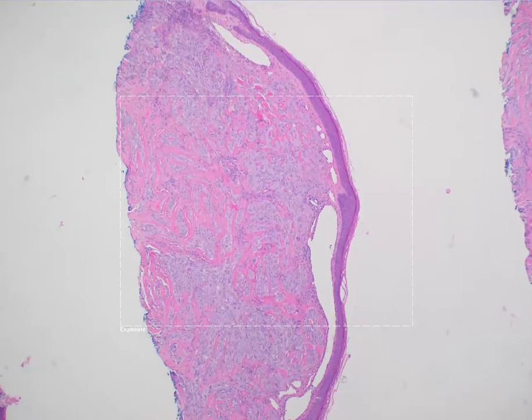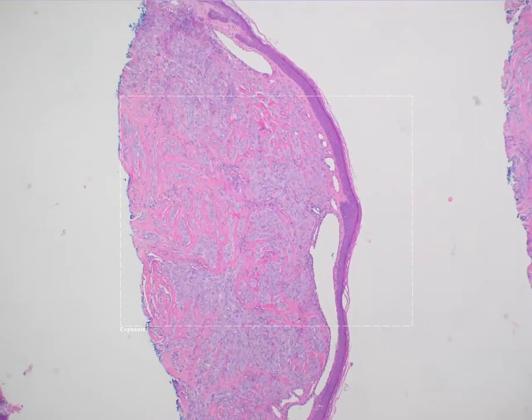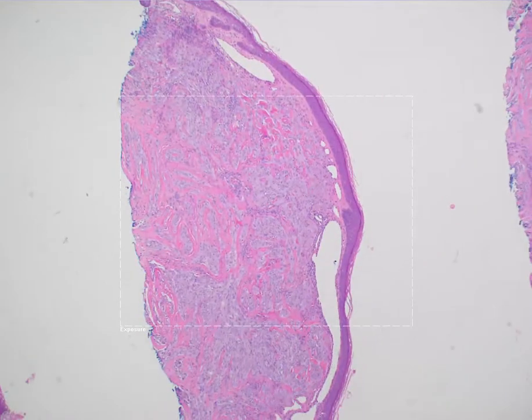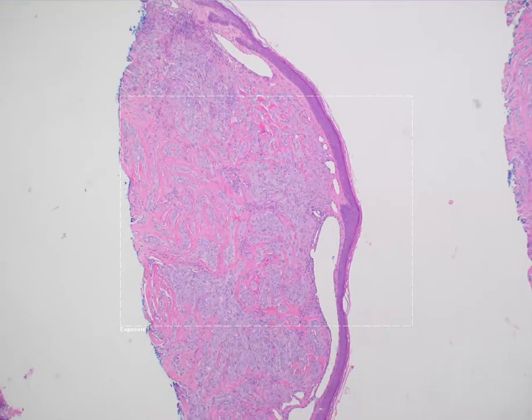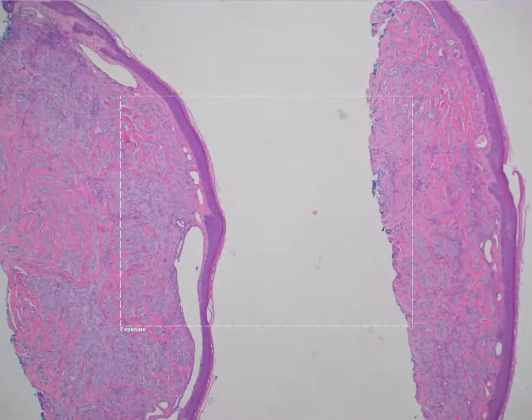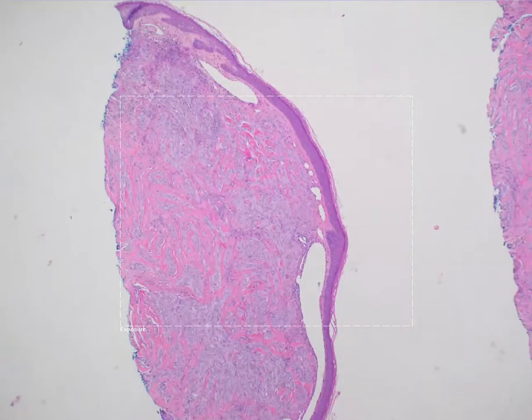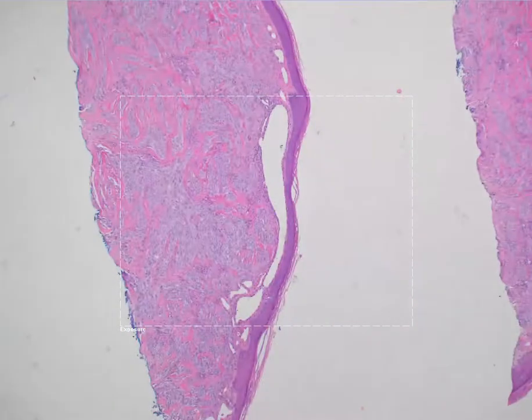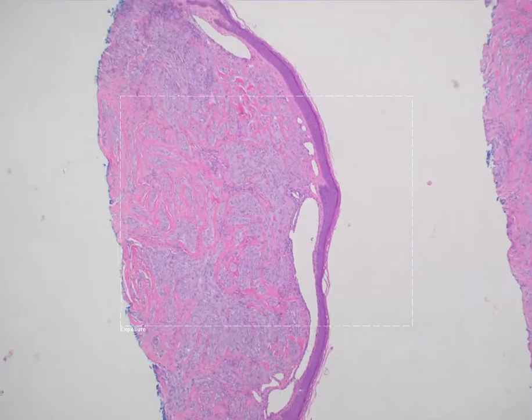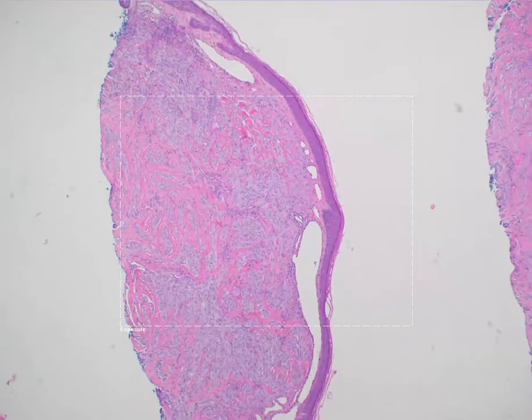This lesion presents more commonly in young adults, and it can involve pretty much any site, but the head and neck region tends to be preferentially involved. Presents as firm pink-red to red-brown papules or nodules. It's a benign entity. It's usually asymptomatic, but occasionally tenderness has been reported with this entity. And histologically, you'll usually see a shaved biopsy because it's a dome-shaped papule. And you'll see these nests and clusters of cells or theques of cells.